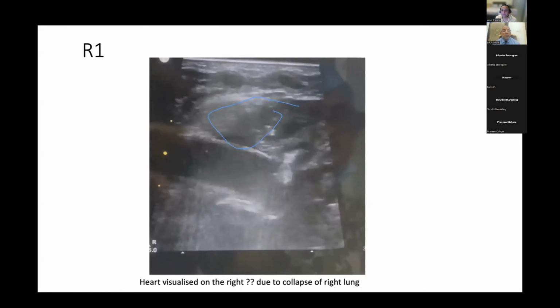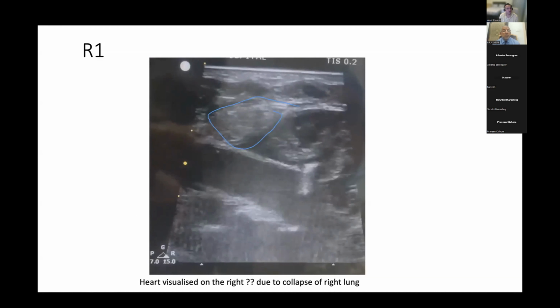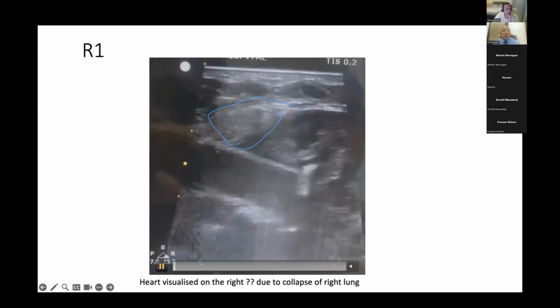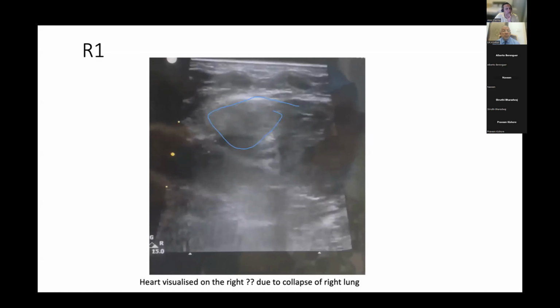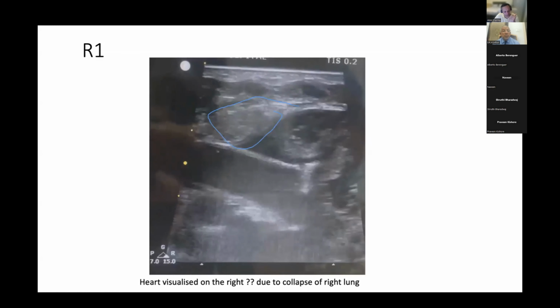If you just saw this image, your mental modeling, you're in R1, you've had a good go at trying to do R1 as you're describing, and this is all you can see in R1. What are your differentials? I want to know if the baby has a large pneumothorax that might displace the heart to the right. I need a comprehensive lung ultrasound as well. Lovely. So left-sided pneumothorax. Anything else?